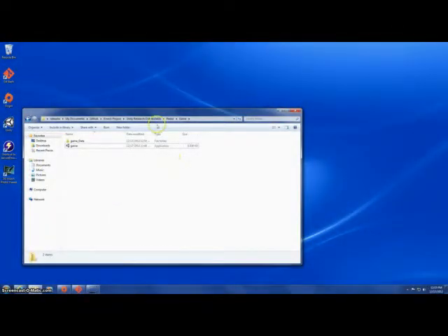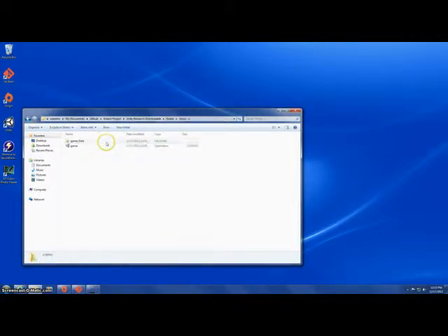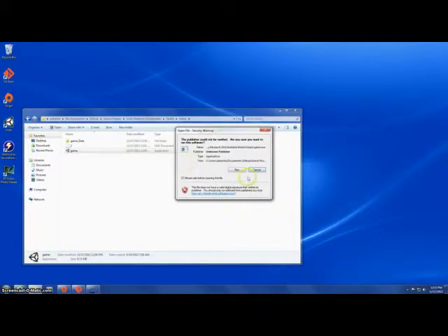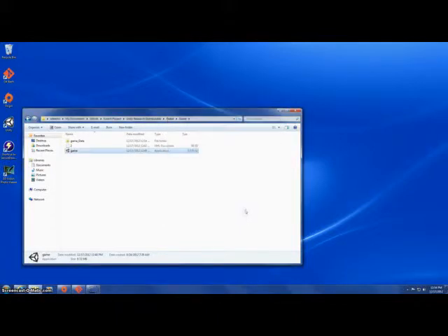Great. Now that the file's been exported, the therapist can copy and paste the file into the same folder that contains the Connect with Therapy application. This will allow the game to find the recorded exercise. In a real situation, the exercise would either be emailed to the patient by the therapist or saved in a cloud system available for easy download. After saving the exercise file into the game-containing folder, the patient may run the game.